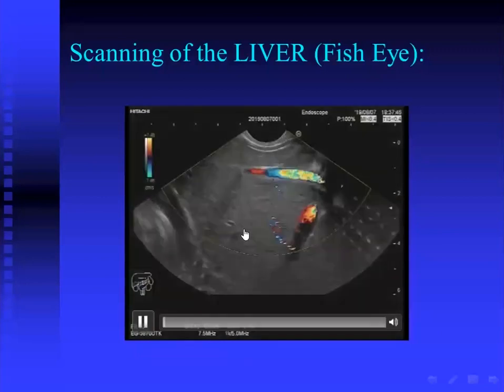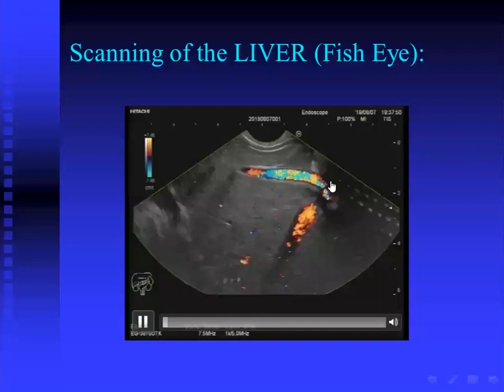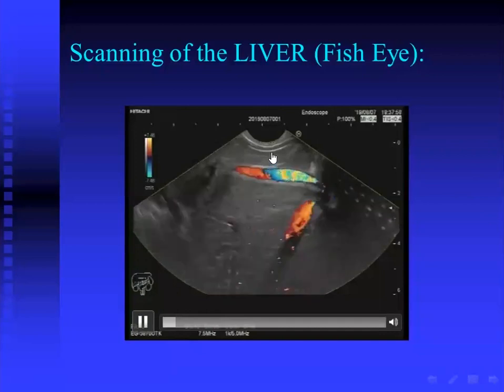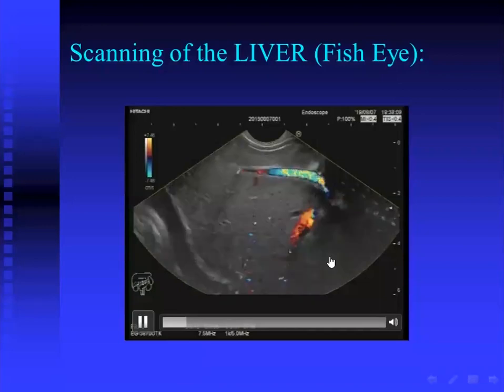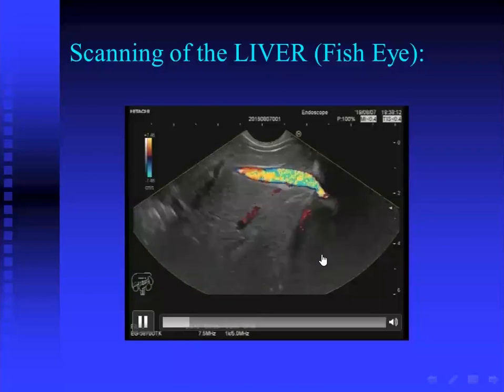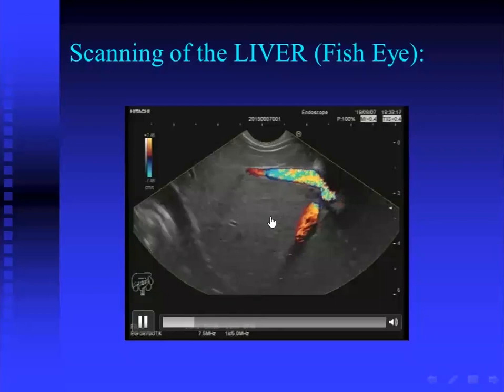But let us start. Our starting point is the inferior vena cava at the right crus of the diaphragm, and this is the intrahepatic portion of the IVC, and this is the right hepatic vein. So segments again: 1, caudate lobe, 8, 7. Then I will do gradual anti-clockwise rotation. This is the right hepatic vein, IVC, and segments 1, 8, and 7 of the liver.